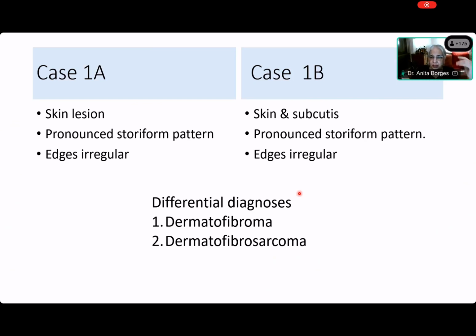Somebody in the chat box is saying irregular edges. Oh, okay. Come on, Elsa. What was your diagnosis on 1A and 1B? Ma'am, 1A I think it's dermatofibroma and 1B could be dermatofibrosarcoma, because the morphology of the spindle cells is a little bit different. In 1B we have seen these slender, thin spindle cells. Okay. And in 1A? 1A has more plump spindle cells. All right. So you think that 1A is a dermatofibroma and 1B is a dermatofibrosarcoma, and you say that because number 2 is much more cellular and it has finer or thin kind of nuclei.